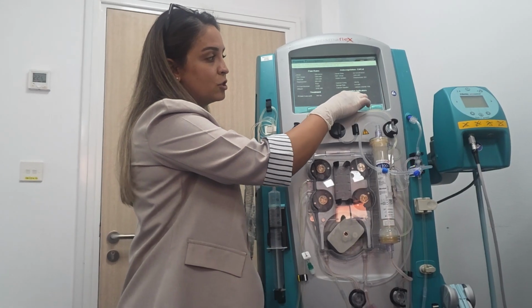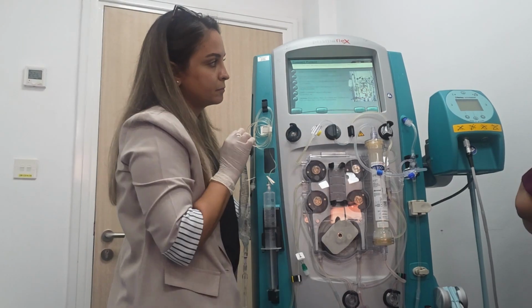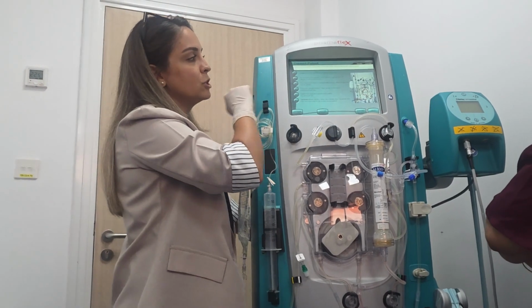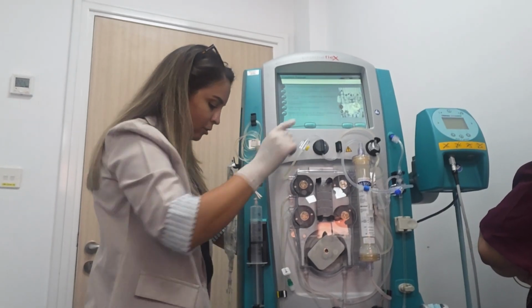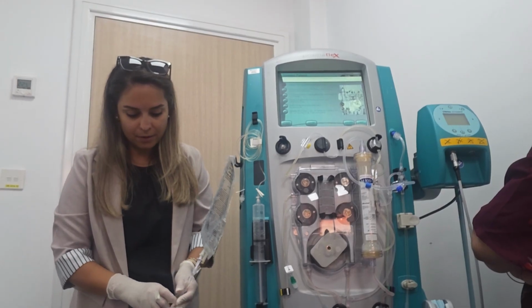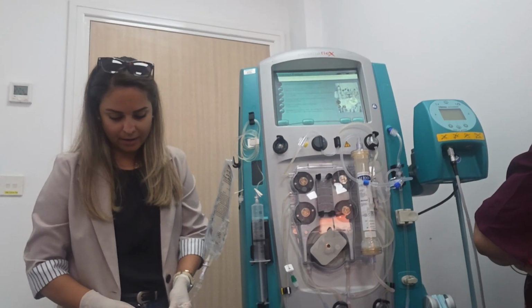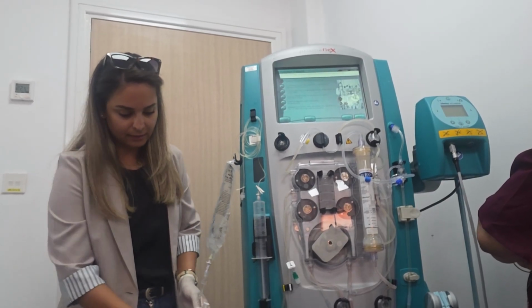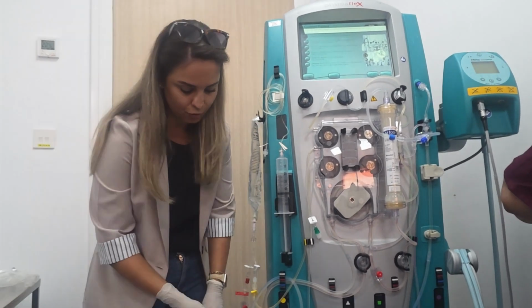Again, filtration fraction, we don't care about. Okay? So just continue. Now let's connect the patient. Number 1, clamp all lines: Y line, access, effluent, return lines. Normally, how do you do it? Normally the same. So clamp here, Y line, access, effluent, and the return.